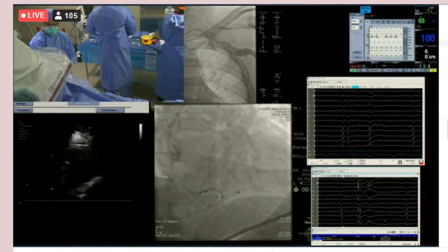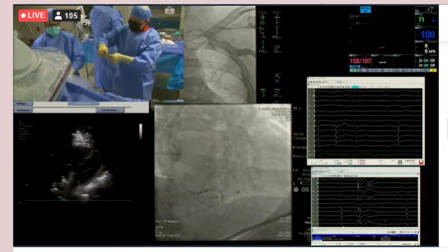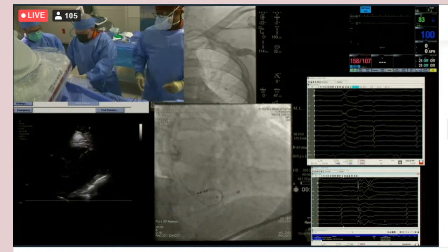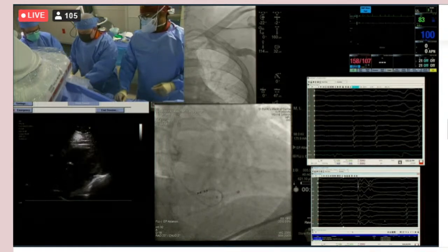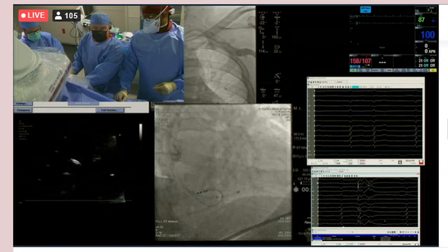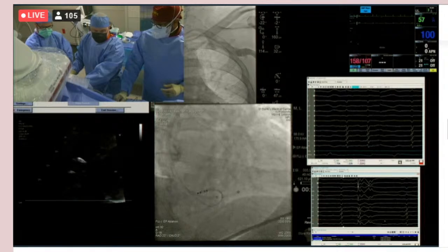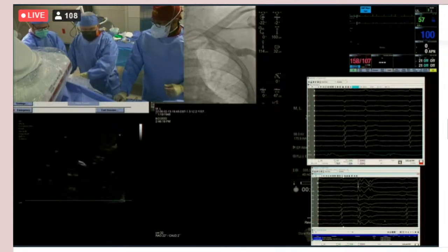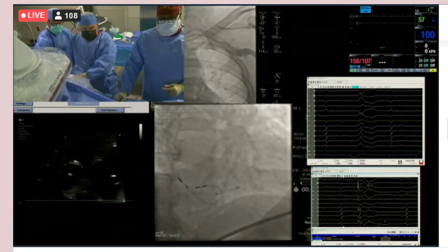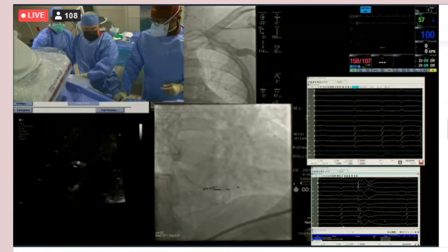So this is a 3830 lead, which is a little bit like trying to screw in a thread. And so we want it as cold as possible because it actually stiffens up when it's cold. So I have some sterile ice cold saline, and I'm dipping it in that to get it as cold as possible. Obviously, when it's in the body, it becomes body temperature pretty quickly, but at least that gets us started. Because once you initiate the penetration into the septum, it usually goes pretty quick.